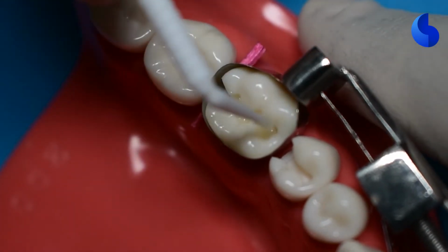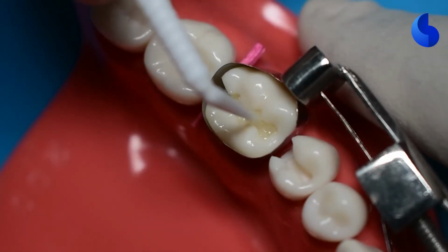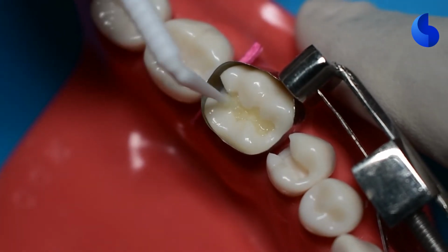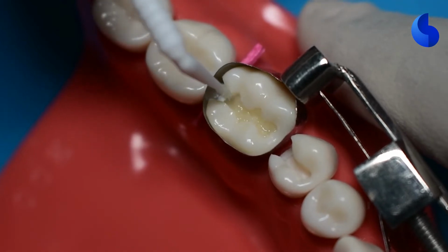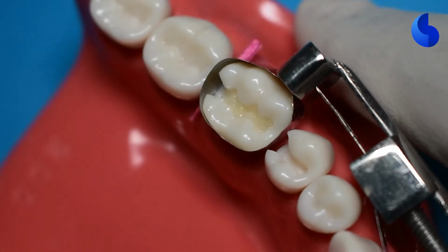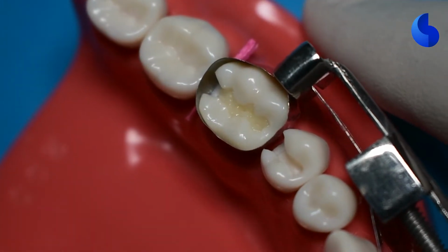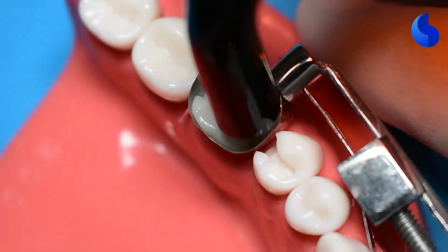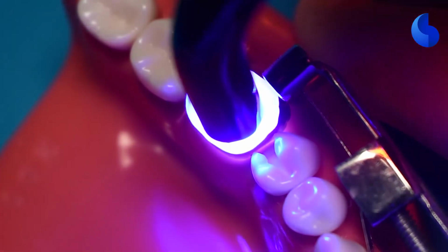Another technique that you can use, which we see over here, is to apply some bonding agent on top of the composite that you just condensed. What the bonding agent does is it helps to improve the plasticity of the material so that it becomes more workable and you're able to create any sort of carving, or it gives a smooth finish at the end.